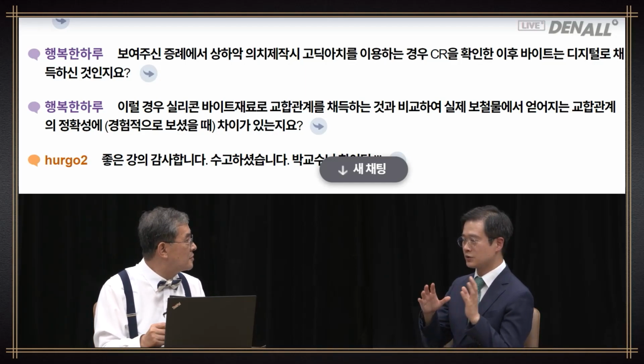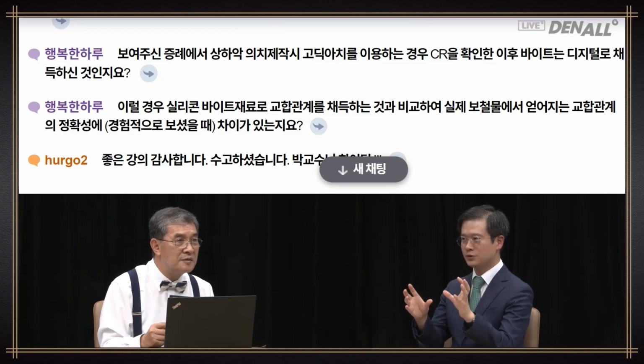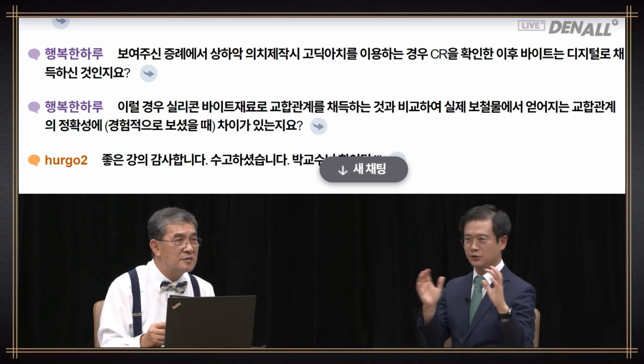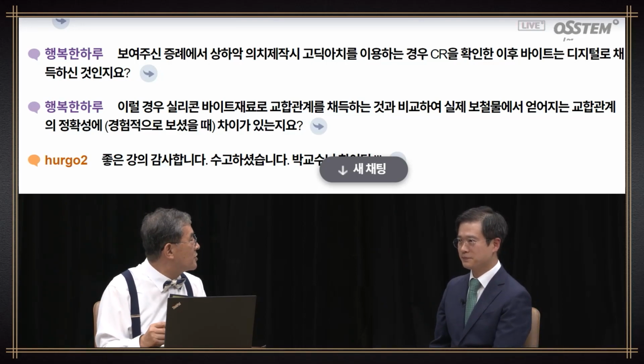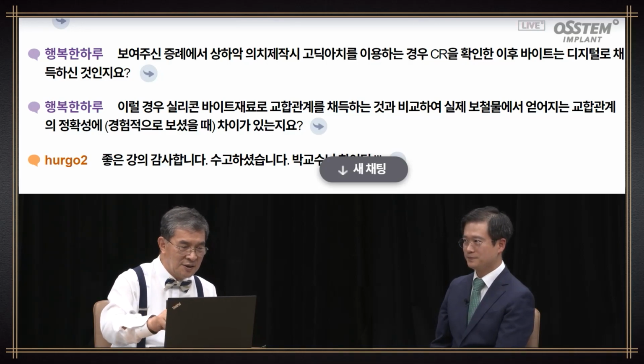As for denture fabrication, a final custom tray for closed mouth is used to take the impression. Model scanning is done. Bite scan is done at the same time. I use silicone bite for that process. If you use silicone bite, you can feel easy about accuracy.